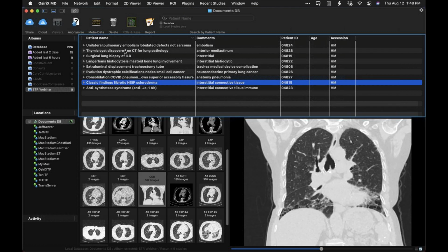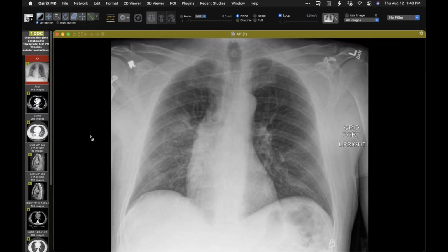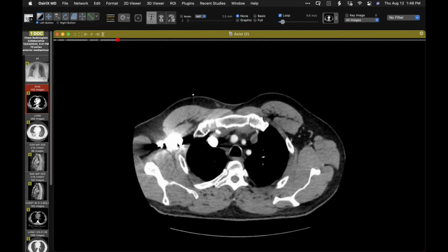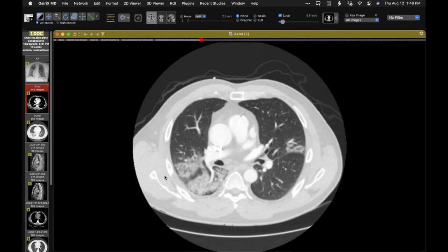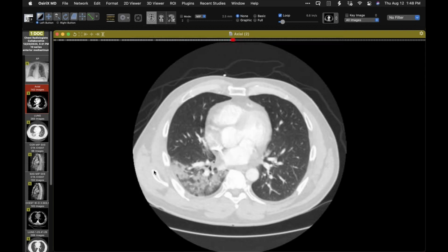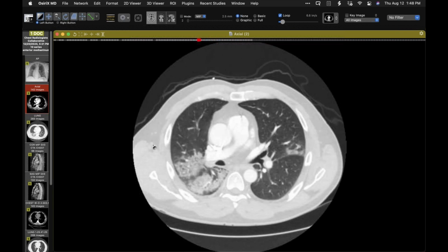Good. Here's kind of an interesting case where I saw it after the event. The history I got for this particular patient is that he had some form of respiratory illness and was imaged at an outside institution for presumably pulmonary embolism, which we didn't have. The bilateral opacities resolved, not due to PE, presumably an infection of some kind. So this goes back to December.